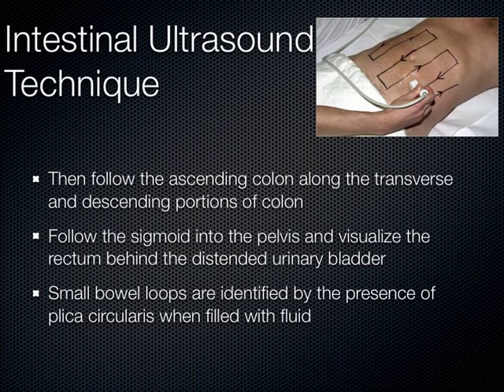When I'm doing a focused appendicitis exam, which I do quite often in the ER, I keep this mowing the lawn technique just around the right lower quadrant where the appendix is located, down there what we call McBurney's point. Or sometimes I just hand the transducer to the patient and say, put this where the pain is. And then they start to push it on their abdominal wall, and they kind of help to localize where I should start my search for the etiology of their pain.